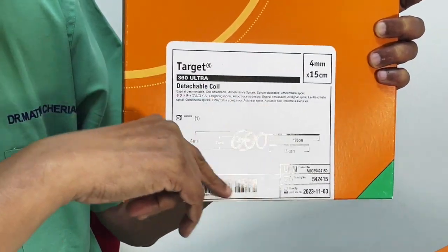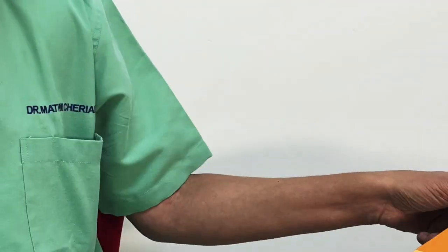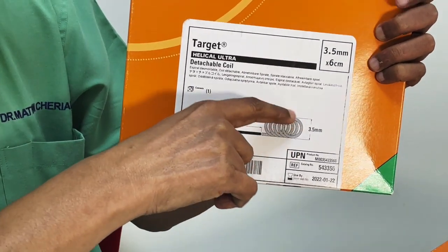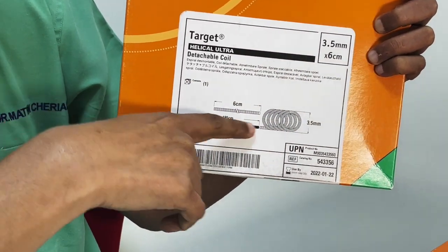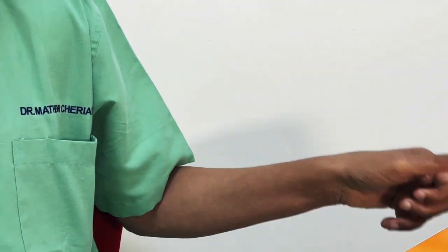Detachment of these coils will vary from company to company, and all of them are excellent coils. So quickly, we're going to run through coils to make you understand. This is another shape. It's called a helical coil. Like I said, helical coils do good packing. There are many companies that make it. We're just running you through, to show you.